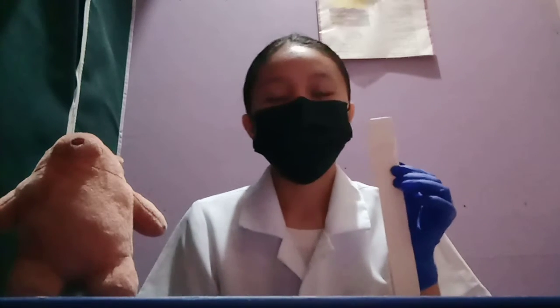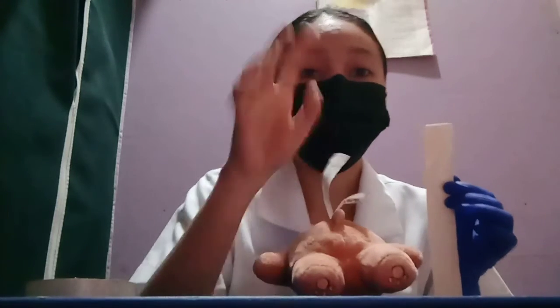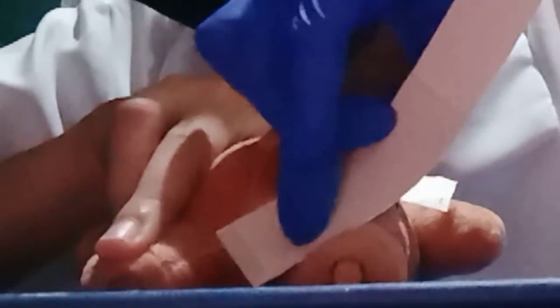When done, take your patient carefully. Separate the buttocks of your patient with one hand, and press the adhesive surface — the sticky side of the tape — against the skin around the rectal area, the right and the left side.